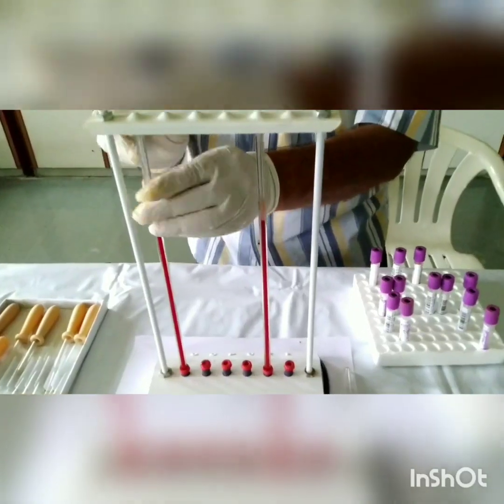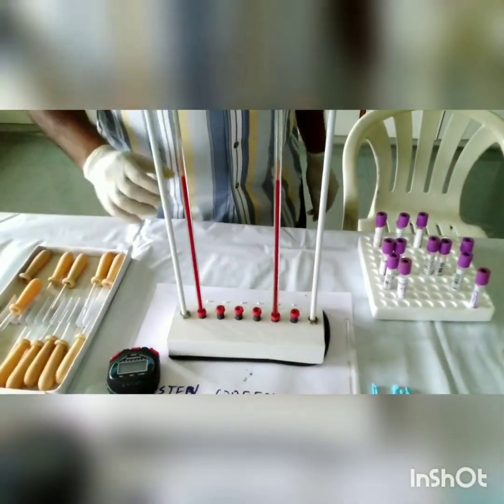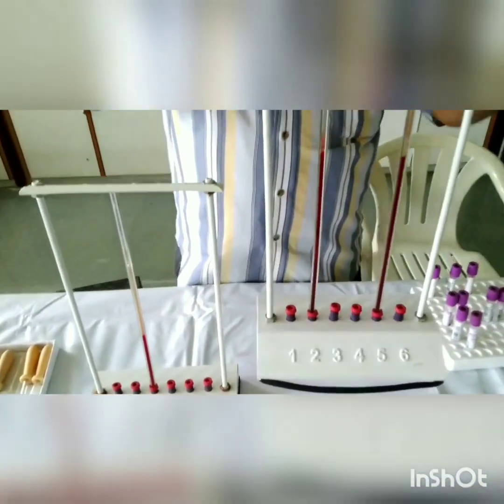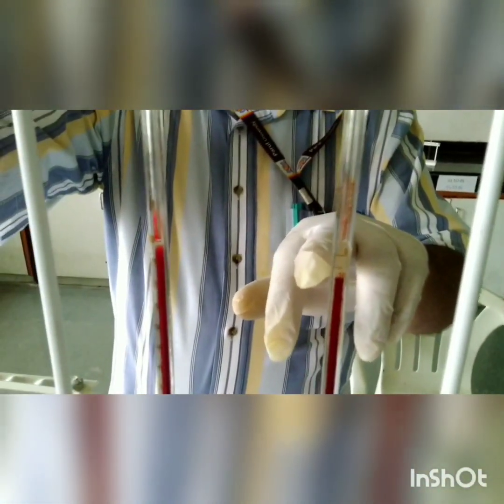Wait for an hour and then take the reading of clear plasma. You will see the settled erythrocytes below the plasma. Observation: you can observe clear plasma.